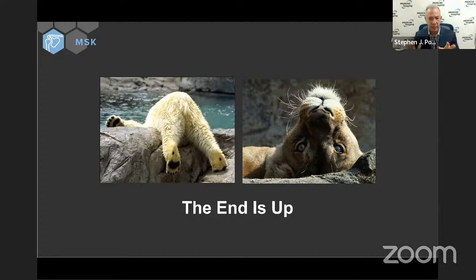If the pathology is in the front and the back, the sagittal and axial are going to be your friends, especially the sagittal. If the pathology is on the sides, then the coronal and, to a lesser extent, the axial are going to be your friends. Any other questions?